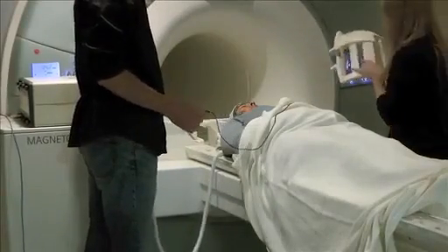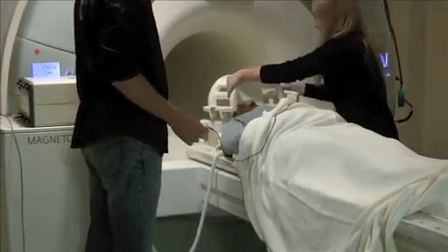We present this method using a unique paradigm, referred to here as the Cold Glove experiment, and record data both before and after hypnotic induction.